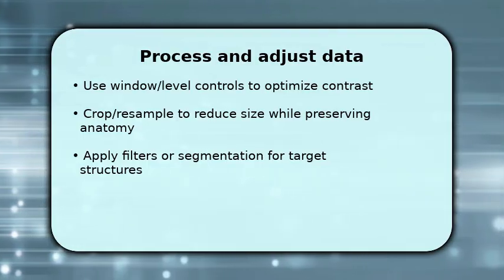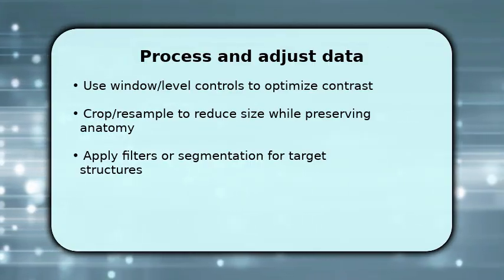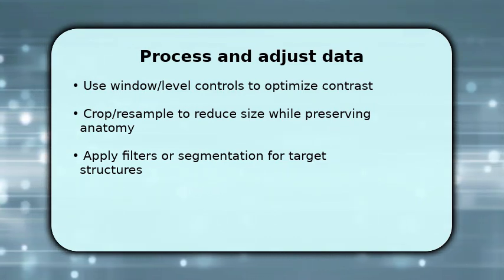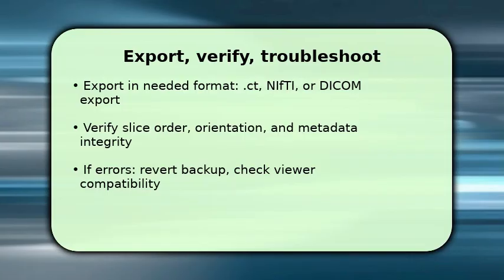Make sure to check voxel dimensions and orientation after each change so scale and alignment stay correct for later use or analysis. You finish by exporting the processed dataset to the required format. Choose NIfTI, or a DICOM export depending on your workflow.